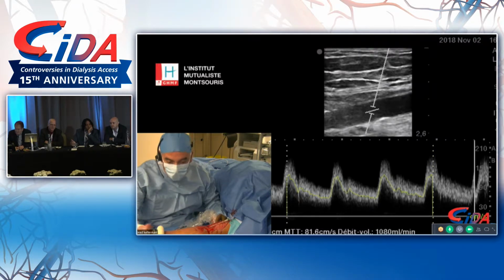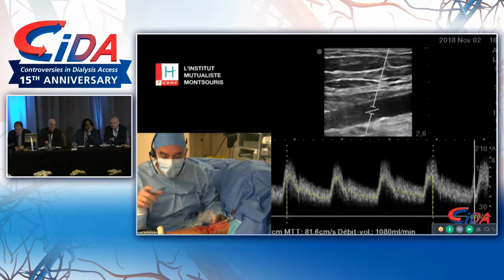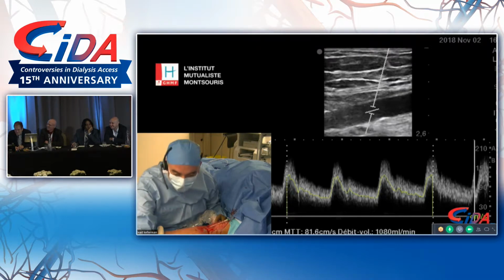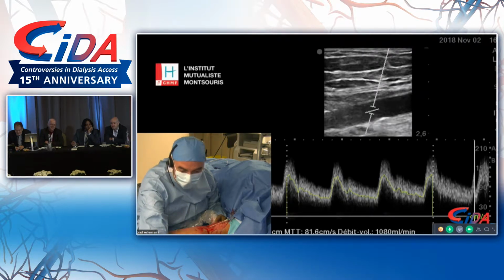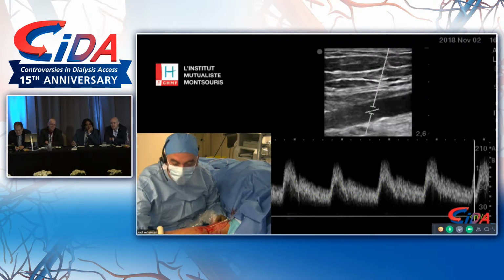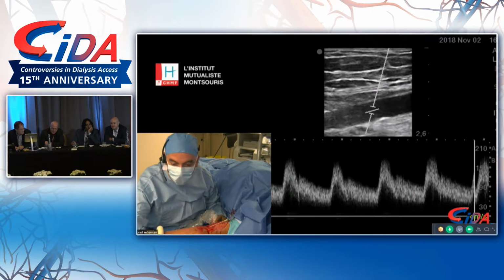If you see, actually, I have a liter of flow here. It's unbelievable. I have a liter of flow. Wow. Are you going to band? Are you going to reduce the flow a little bit? I don't know. I think perhaps I'm going to measure it. Open the gate. I overestimated a bit. I opened the gate a bit. Yeah, I think I'm cheating a bit.